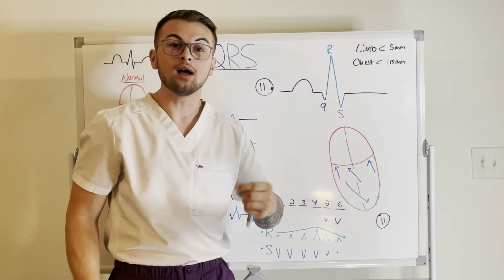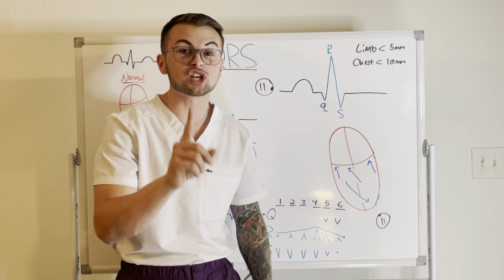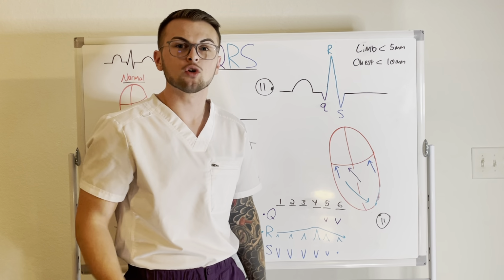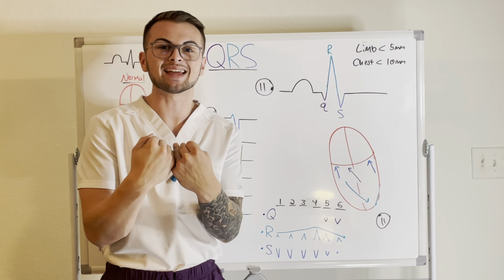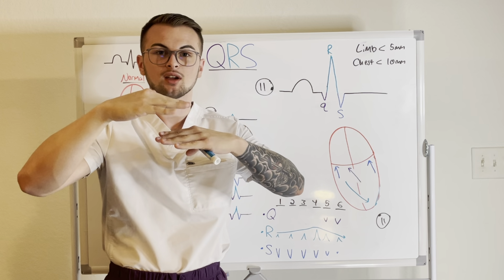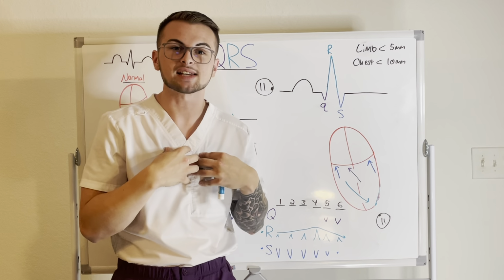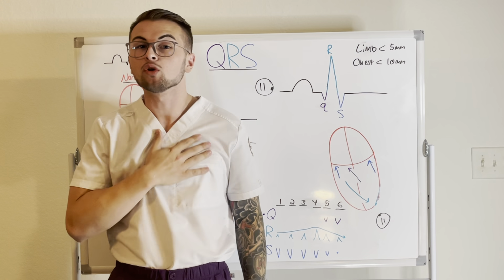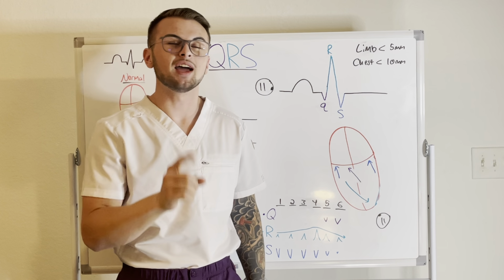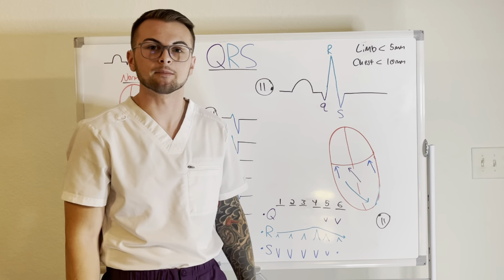So we should know the normal progression of the chest leads if we are to truly analyze the QRS complex. Remember that the chest leads are looking into the heart to cut it into top and bottom halves. Also, because the chest leads or precordial leads are closer physically to the heart, they also have higher amplitudes, and we'll see why this is important in just a second.